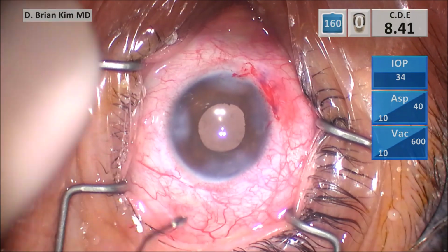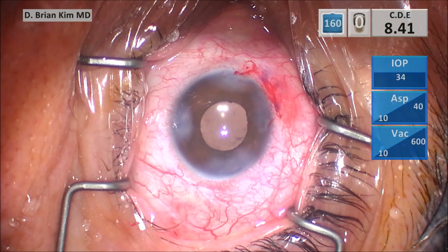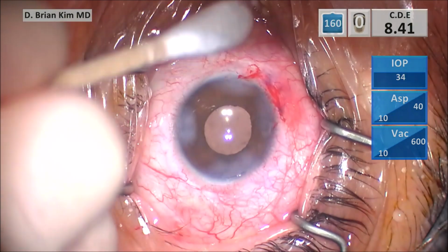So this patient had immediate improved vision and noticed significant improvement of his glare, again, because we repaired the iridodialysis using the sewing machine technique.